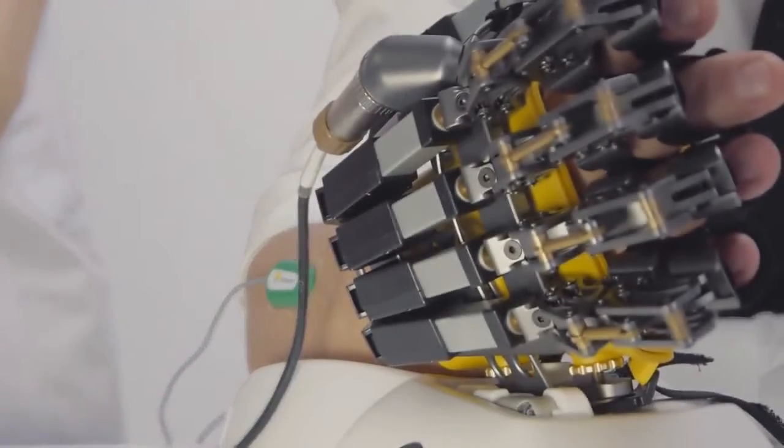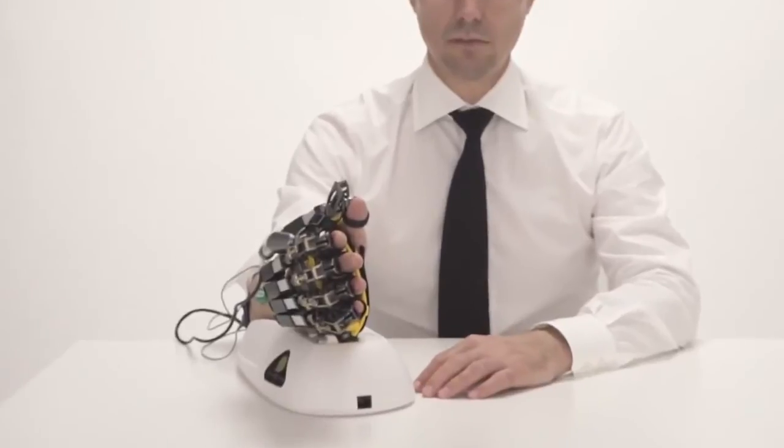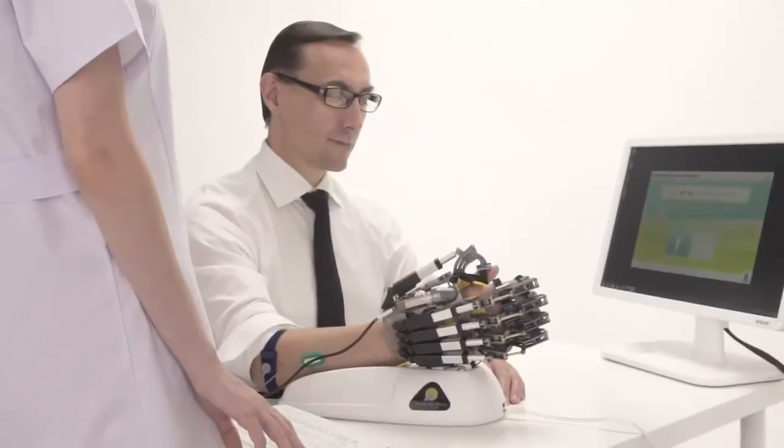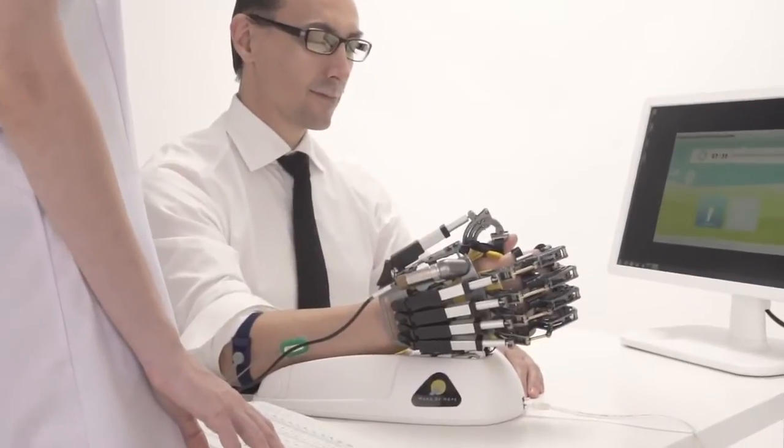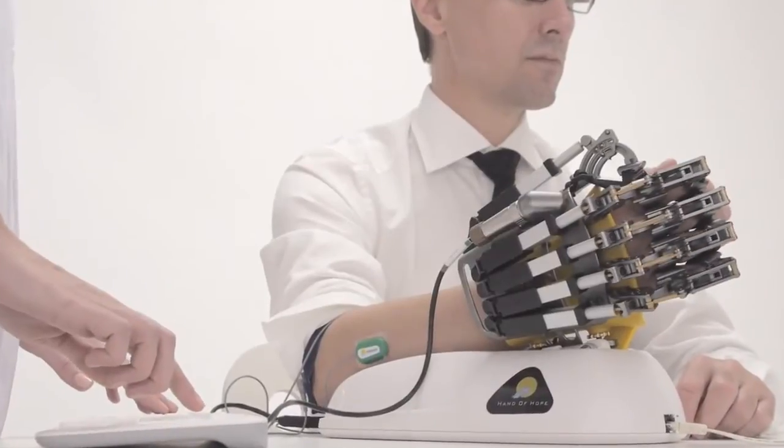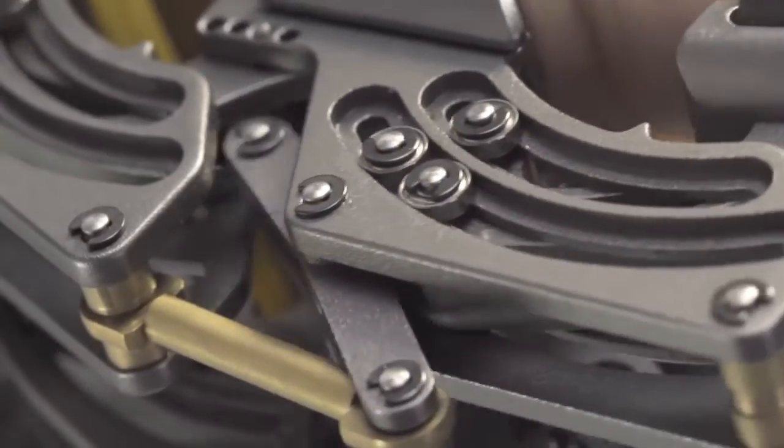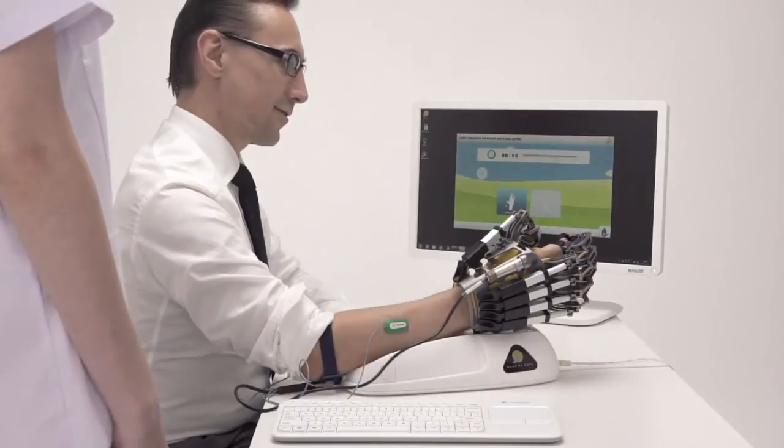Hand of Hope detects the patient's intentions to move the impaired hand. Voluntary EMG signals are commanded by the brain and detected by sensors. As an active and assistive device, it processes these signals and delivers them to the hand brace. In that way, the robotic arm understands that the patient wants to open or grasp the hand.